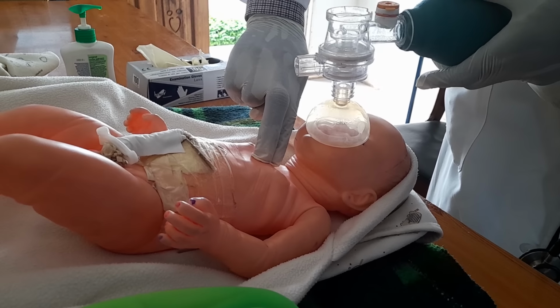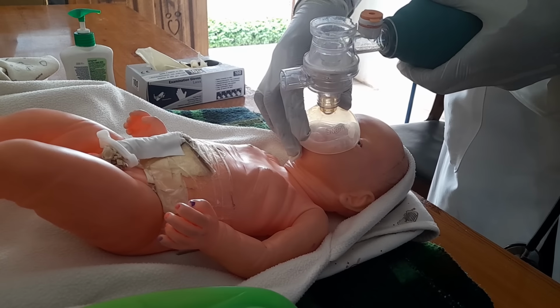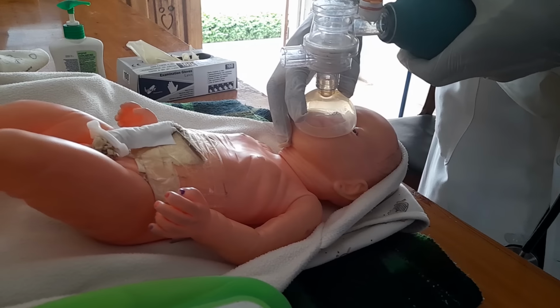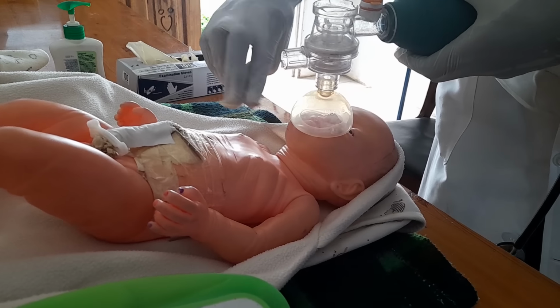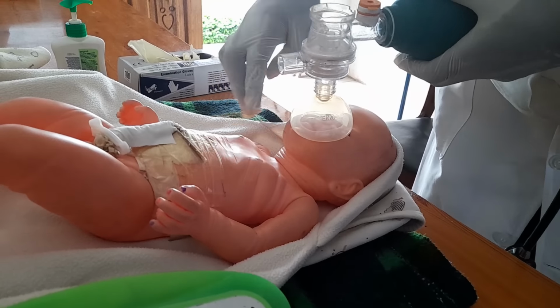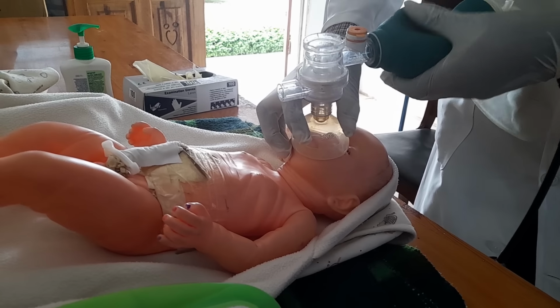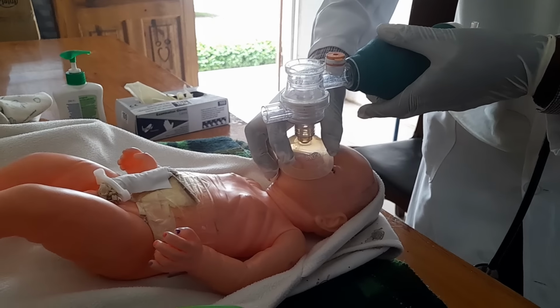They have to be fast, so just brisk, 1, 2, 3, okay? Then you give another ventilation, 1, then another set of compressions, which is 1, 2, 3. Then ventilation will go, making a C here, 1. Okay, so you can show the examiner that you've done even 3 times.